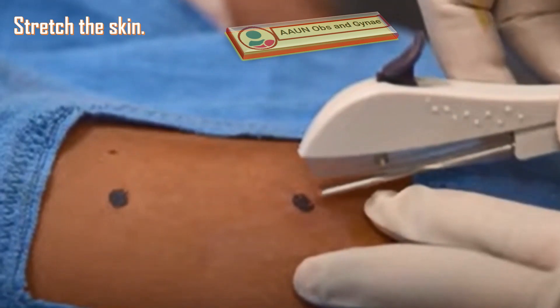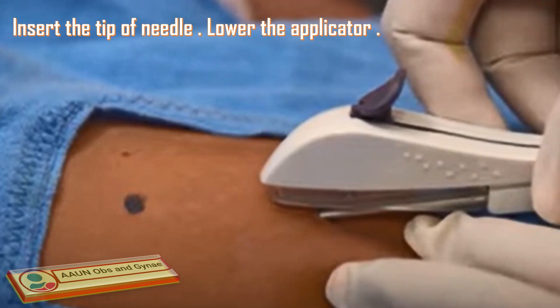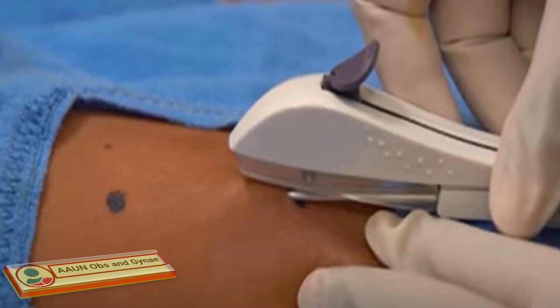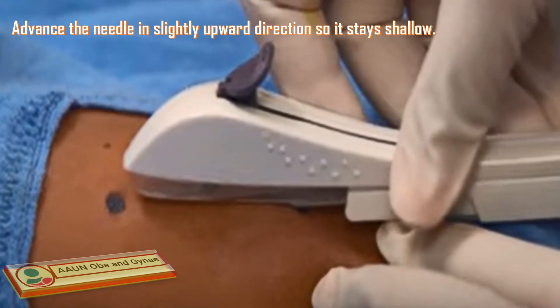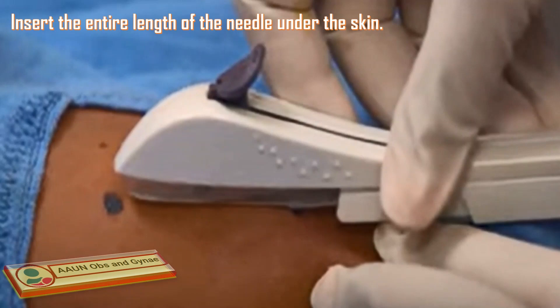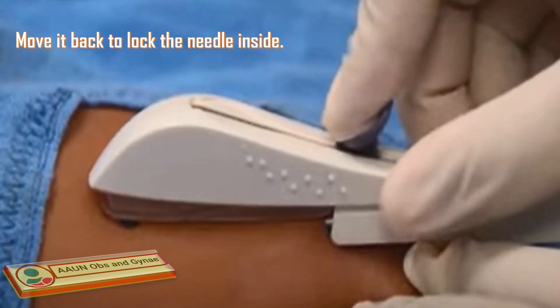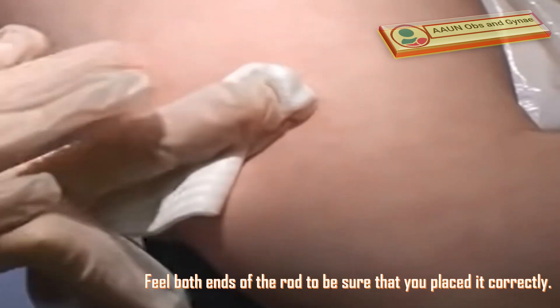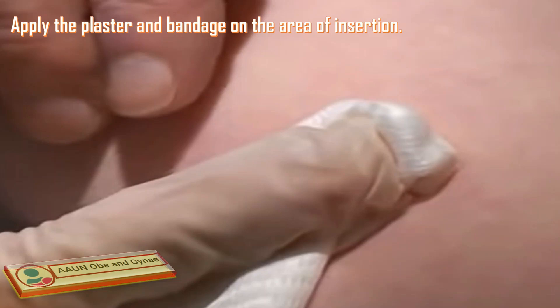Now stretch the skin and insert the tip of the needle below into the first mark made. Lower the applicator to its level, then advance the needle in a slightly upward direction so it stays shallow. Insert the entire length of the needle under the skin. Unlock the applicator and move it back to lock the needle inside. Feel both ends of the rod to be sure that you placed it correctly. Apply plaster and bandage on the area of insertion.